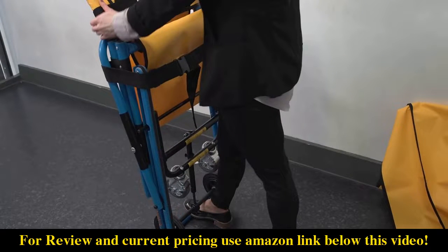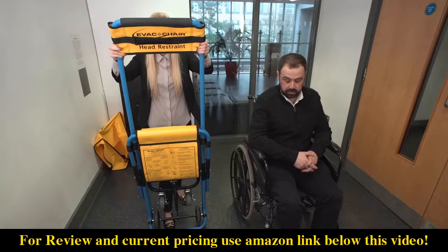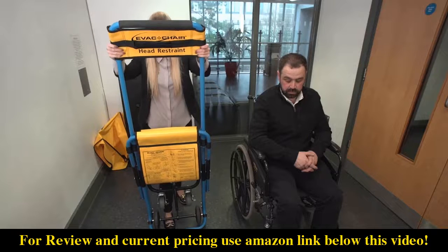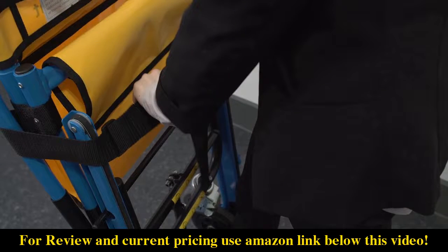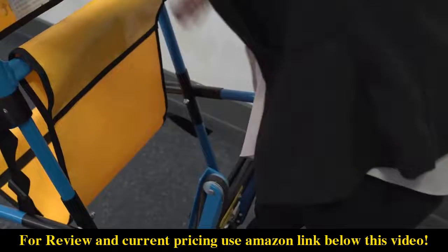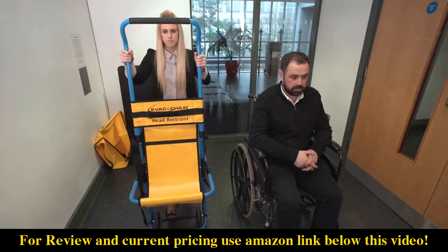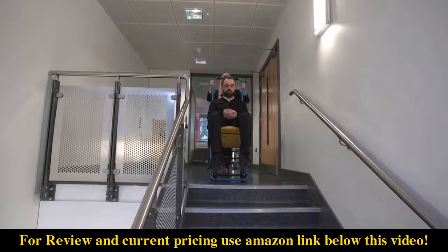While standing behind the EvacChair, hold it upright with one foot on the blue base frame. Using both hands, pull the handle until the securing clips are locked in place. Slide the head restraint down. Unbuckle the passenger safety belt to release the chair tracks and pull the chair tracks towards you. Slide the seat frame up until it stops and locks into place. The occupant can self-transfer or can be transferred in line with their healthcare professional. Your EvacChair is now ready to use.